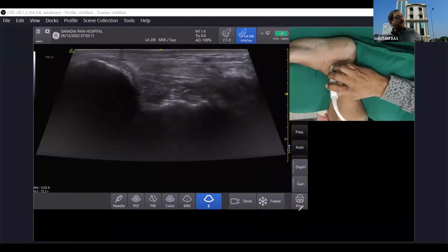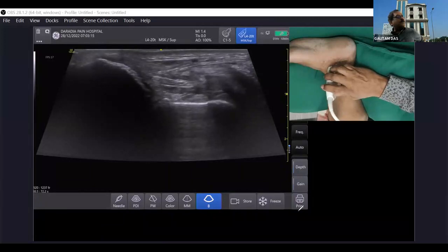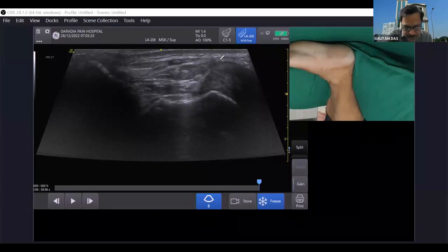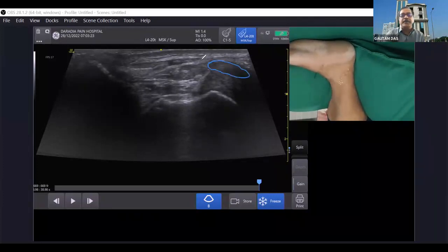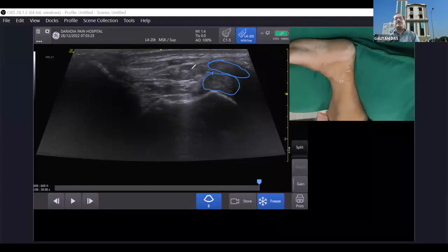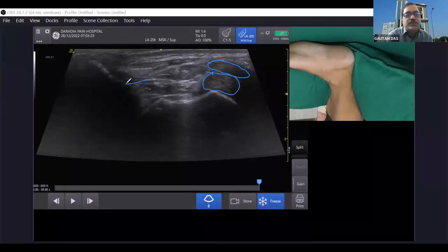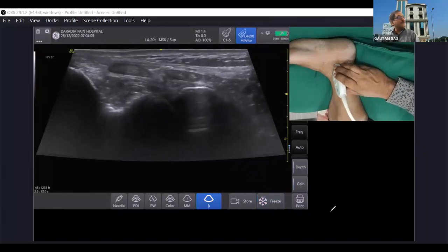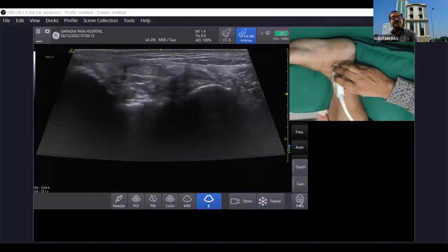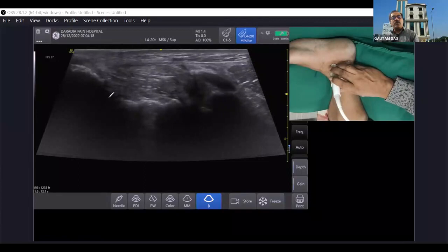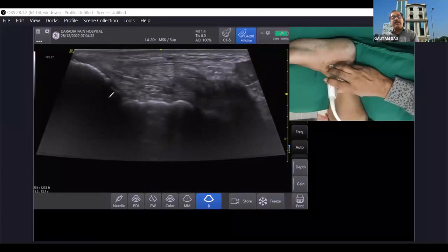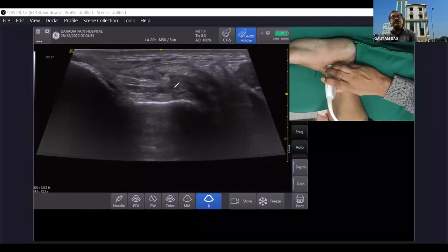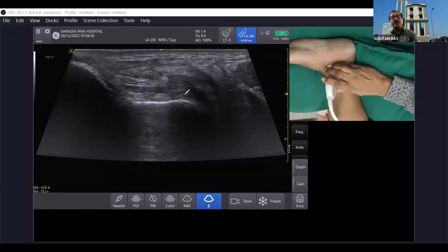Moving more anteriorly, the tibio-spring ligament is now appearing very nicely. The tibialis posterior tendon has come into view, and below it is the spring ligament in short axis, appearing slightly hypoechoic. Continuing — the sustentaculum tali is visible, and then moving more anteriorly with the distal end of the probe, the tibio-spring ligament gradually comes in. In this position, tibialis posterior is above and the tibio-spring ligament is clearly below it.